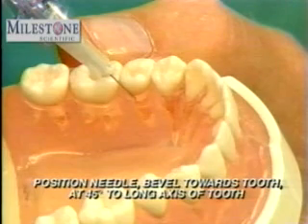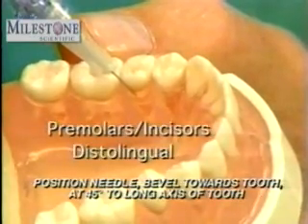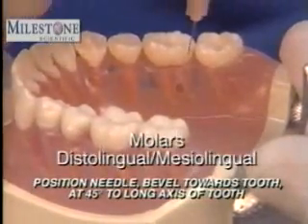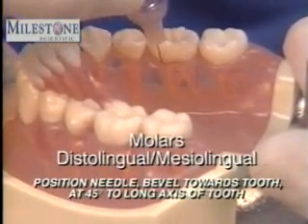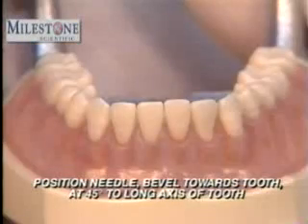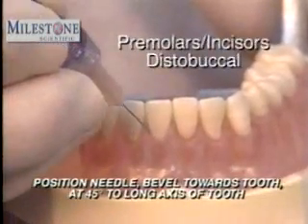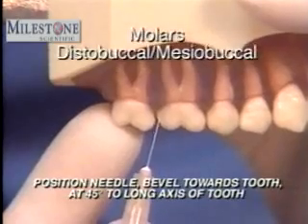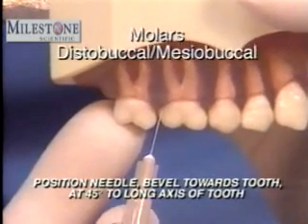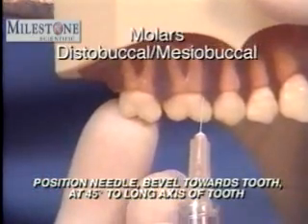On mandibular premolars and on incisor teeth, one site, the distolingual line angle, is recommended, while on mandibular molars, two sites, the distolingual line angle and the mesiolingual line angle, are recommended. Site selection in the maxilla is equally important and is similar to that in the mandible. On the premolar and the incisor teeth, one insertion site, the distobuccal line angle, is going to be used, while on the maxillary molars, two injection sites, the distobuccal line angle and the mesiobuccal line angle will be used.